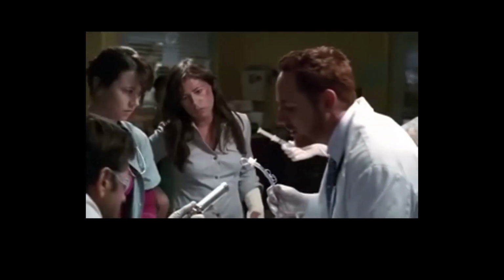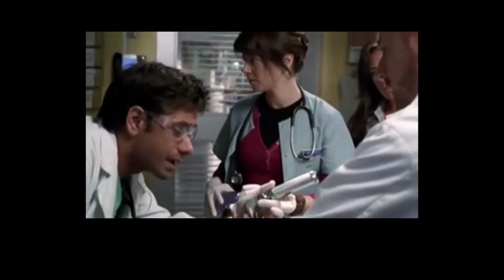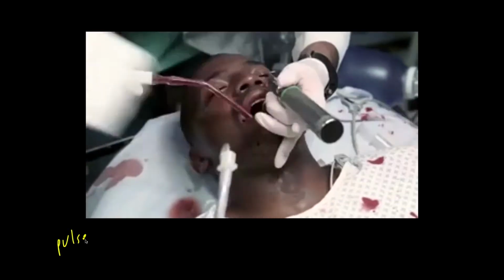You see the cords. Too much blood. What about cricoid? Anatomy's distorted. Now you're making it worse. Pulse ox down to 80.